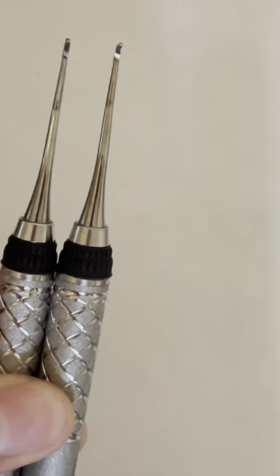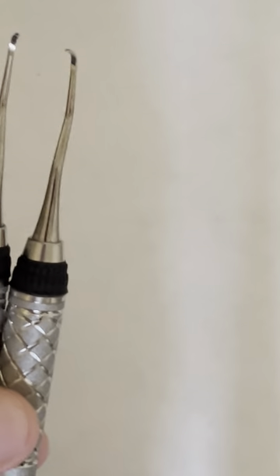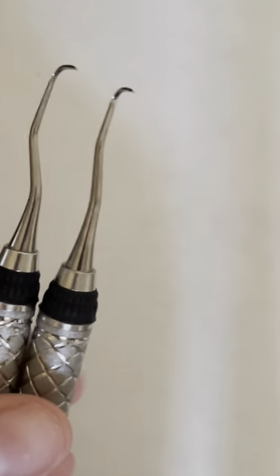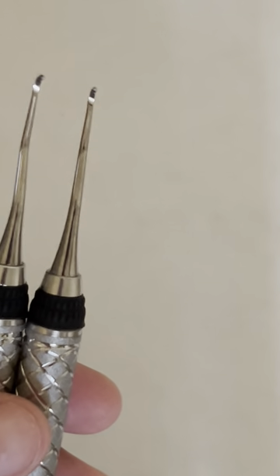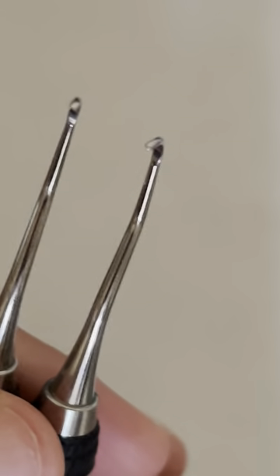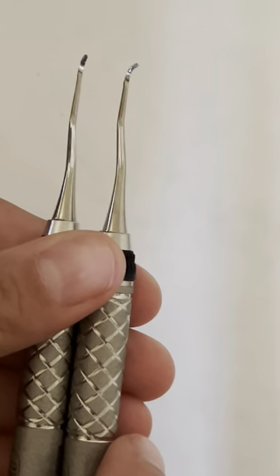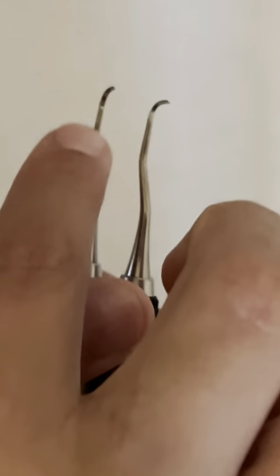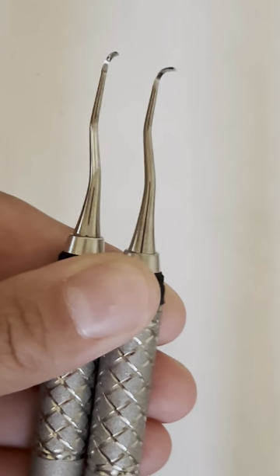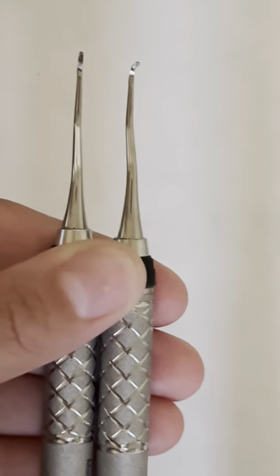Looking at the Gracey 1/2 versus 5/6 — I think the 1/2 looks the tiniest bit shorter. Even on this side when you look at it, it looks shorter. I think the terminal end on the 5/6 is a little bit bigger than the 1/2. Even if you look at it this way, I think 1/2 is shorter than the 5/6.